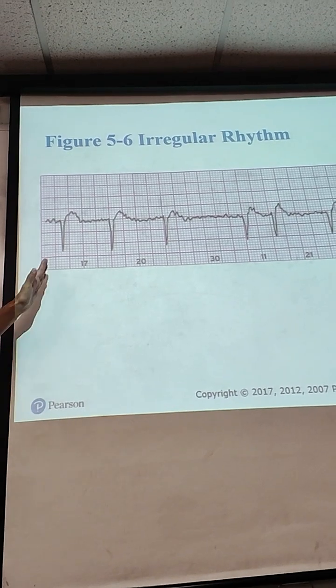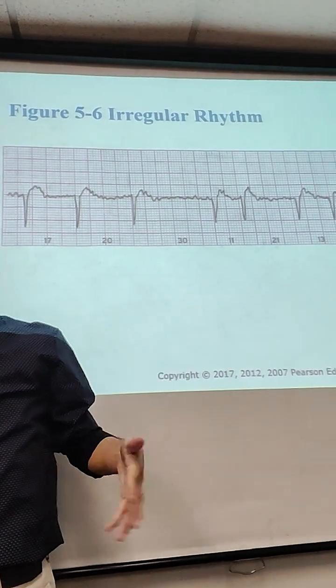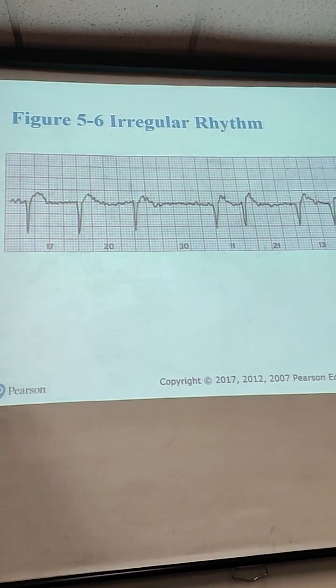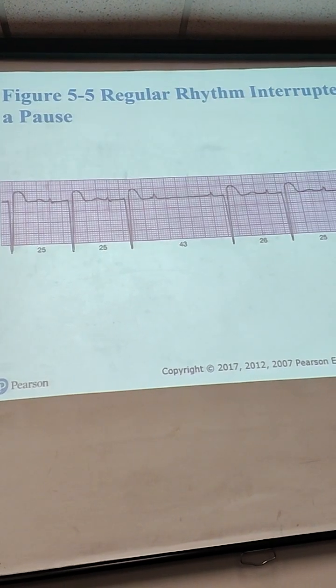It will be counting the number of QRS and multiplying them by 10. Remember, that's how it works.